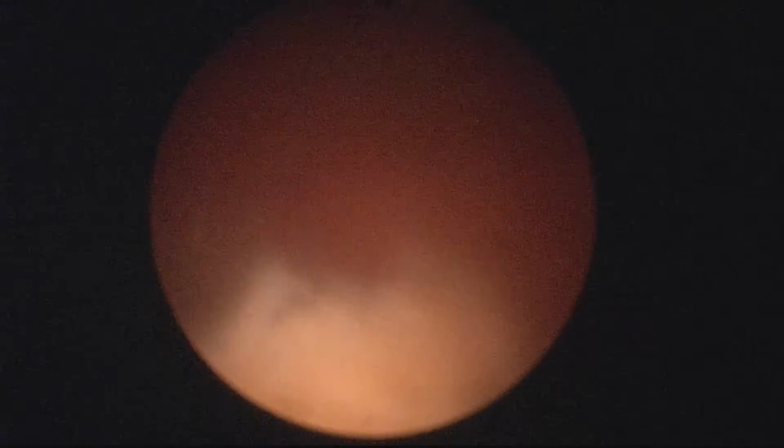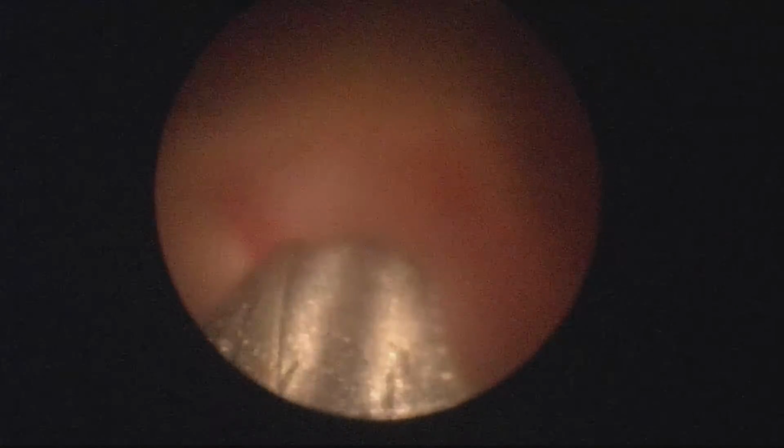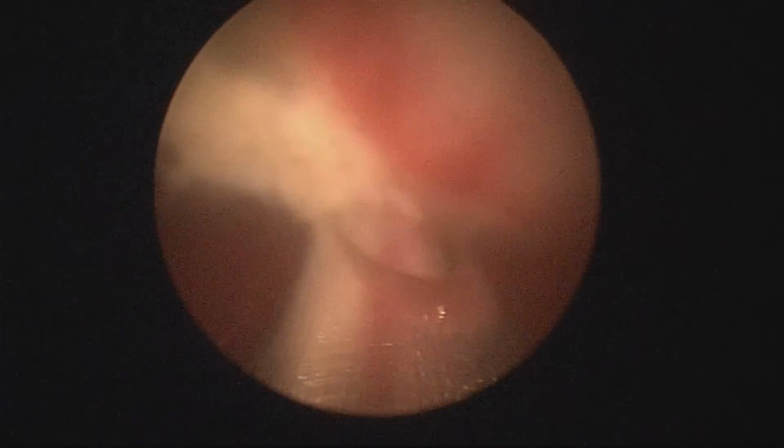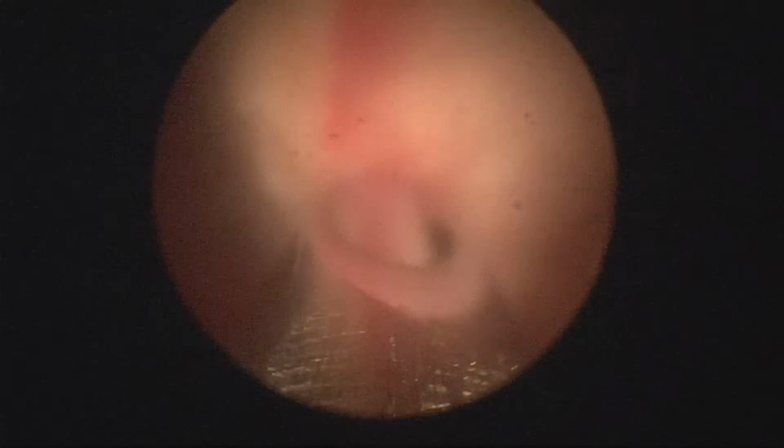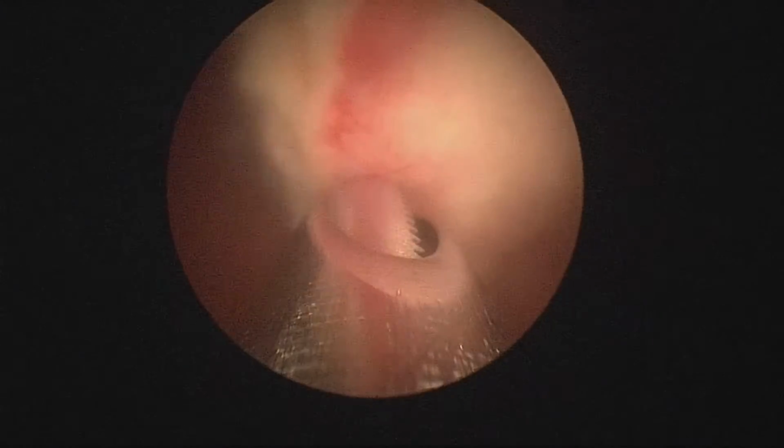This is an unedited video, so I'm not cutting anything, just showing you the real-time work. And here I changed, and the next thing, of course, we're going to do is the morcellation of the piece. So here I changed to the morcellator. I was trying to say that the plan was to take a biopsy of the diverticulum. I tried to focus for a moment.